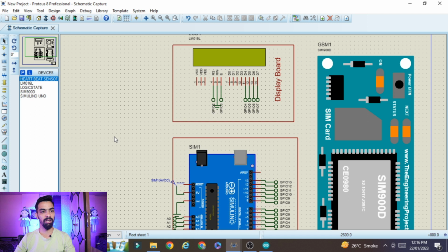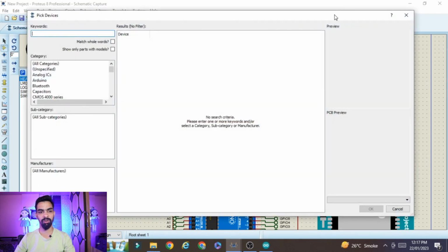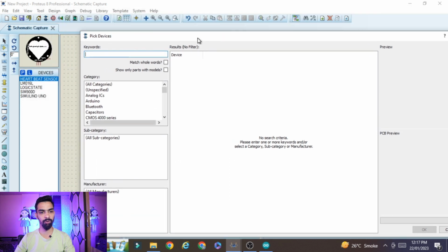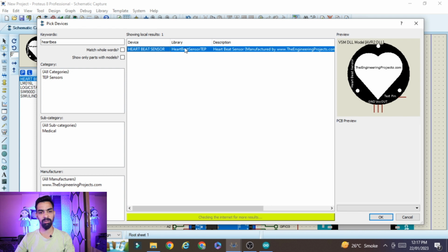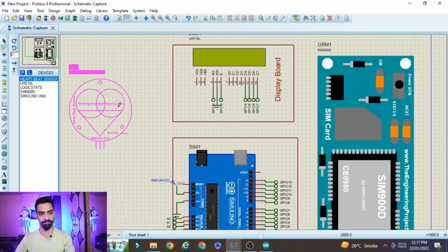Then you can go to the component mode and click on P. After you restart, open the project, go to component mode, click on P, and here you can type heartbeat. Once you type heartbeat, you will find this sensor in the library. Click on OK and place that sensor here.